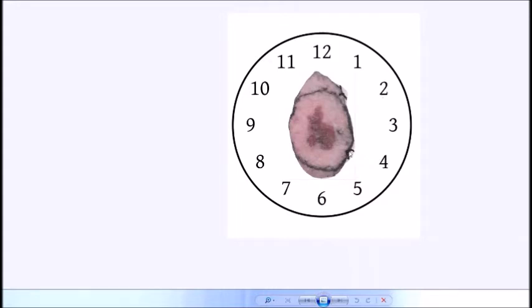You could probably get away with saying this is 1 o'clock here and maybe even 3 o'clock, well, probably 3:30-ish, 4 o'clock here. Anyways, I designated these as 2 o'clock and 4 o'clock. I just wanted you to see how I got that clock face and how I redesignated those sutures per clock face.